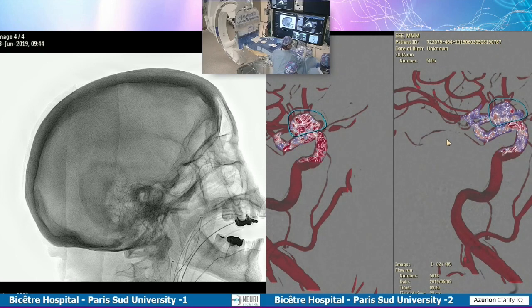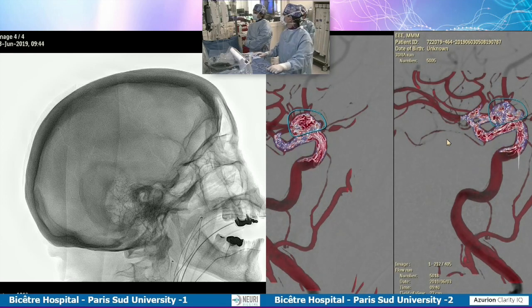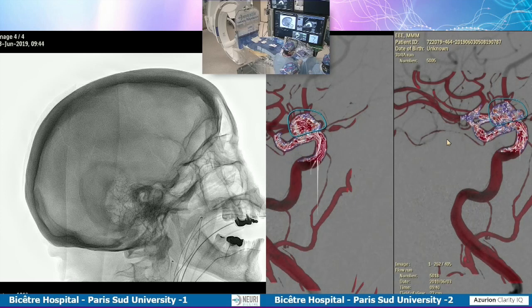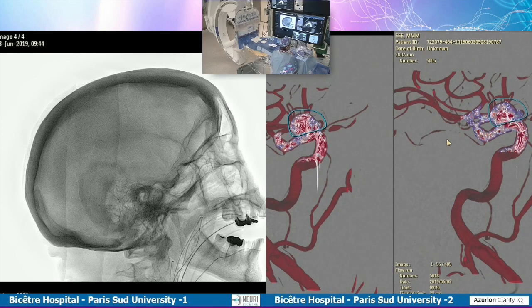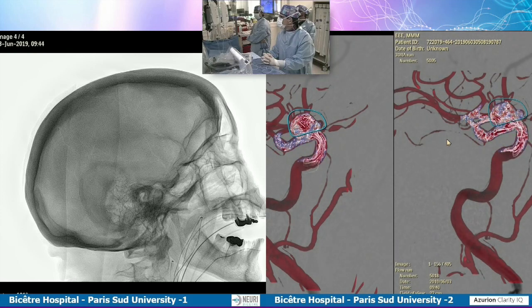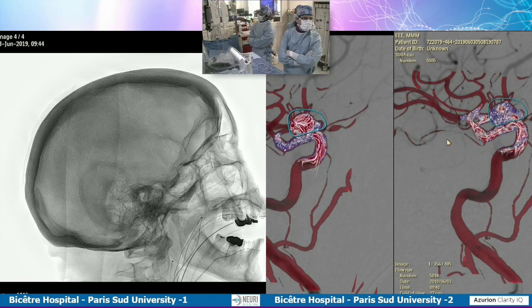Okay, you may see but it's cropped probably, so you don't see the MAFA calculation, unfortunately. If somebody can tell me the MAFA calculation, please. So the MAFA is 0.61. 0.61, so it's below 1. As you can see, probably it's a little bit cropped on the right-hand side. You have a huge decrease in the flow in the aneurysm, 0.61. So normally when it's less than 1, you have quite a kind of arguments to foresee that you will have a delayed thrombosis of the aneurysm.